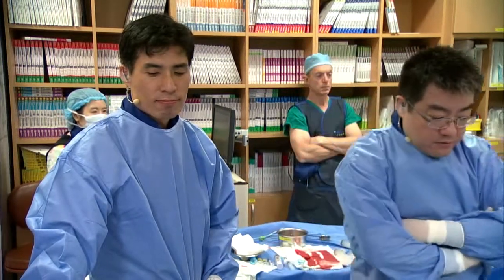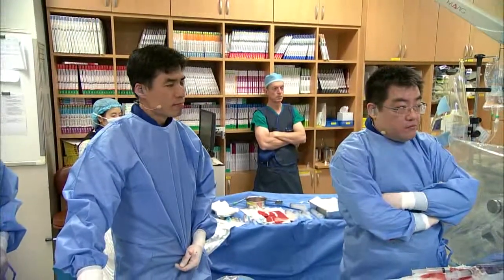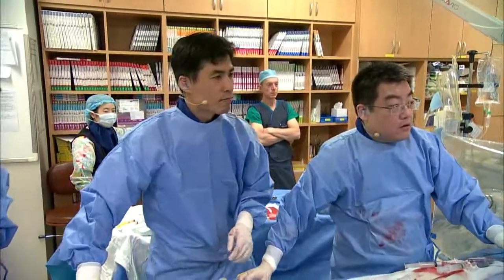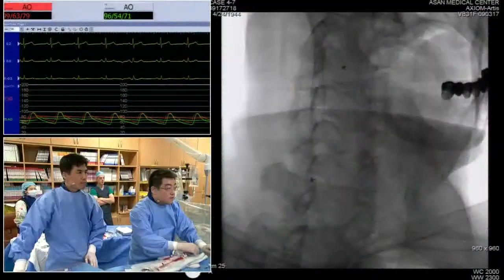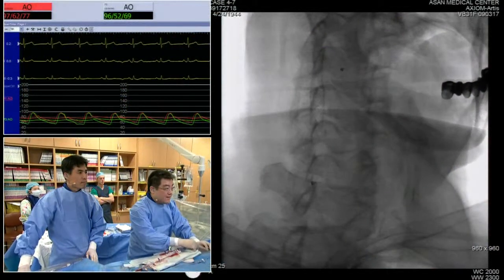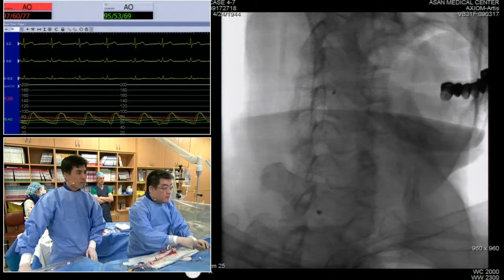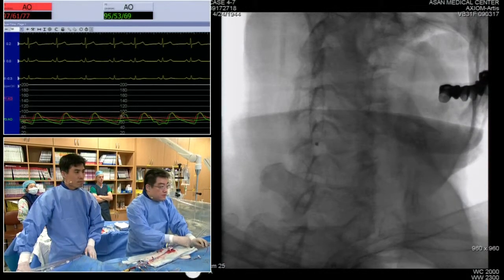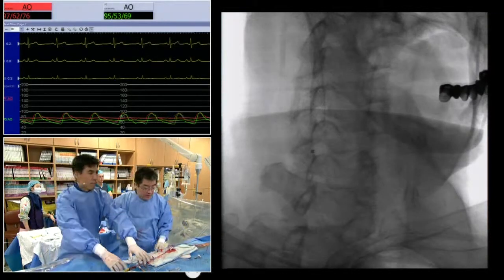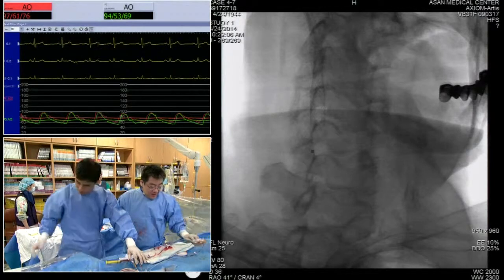Dr. Gao, when you prepare to do something in the carotid artery and incidentally find an intracranial aneurysm, in this situation, is the aneurysm treatment first, or the carotid treatment first? Nowadays, because all my patients have a pre-procedural CT angio, usually this is not going to happen.